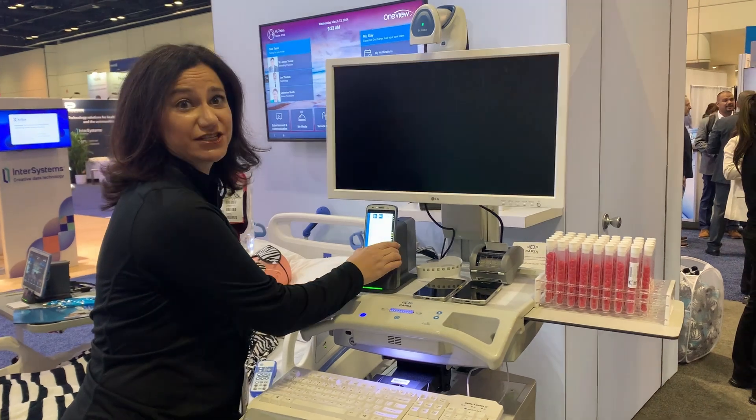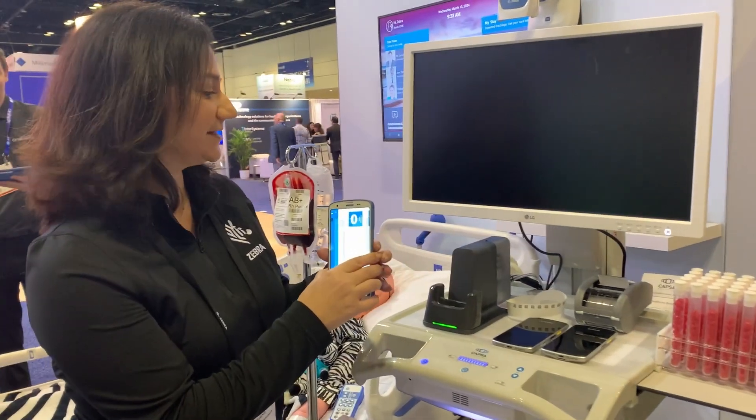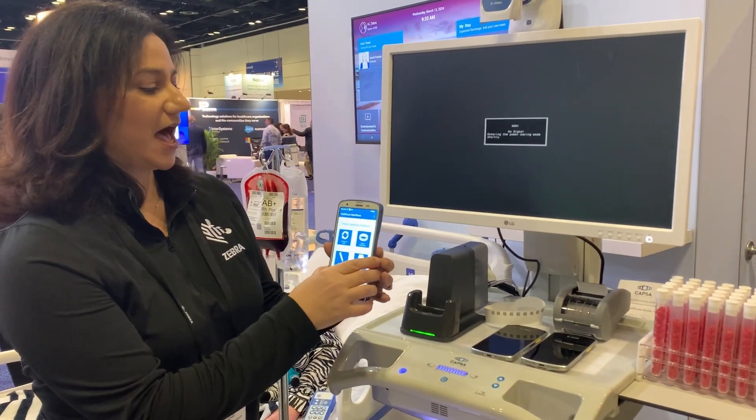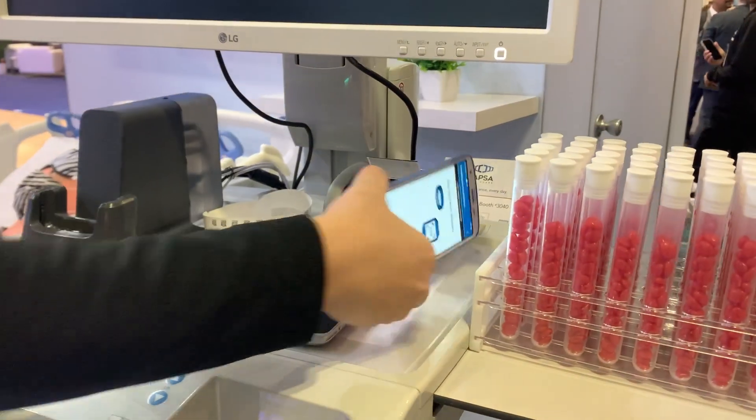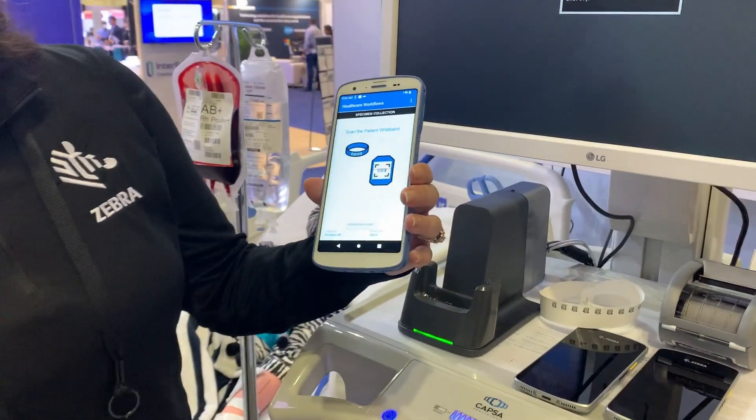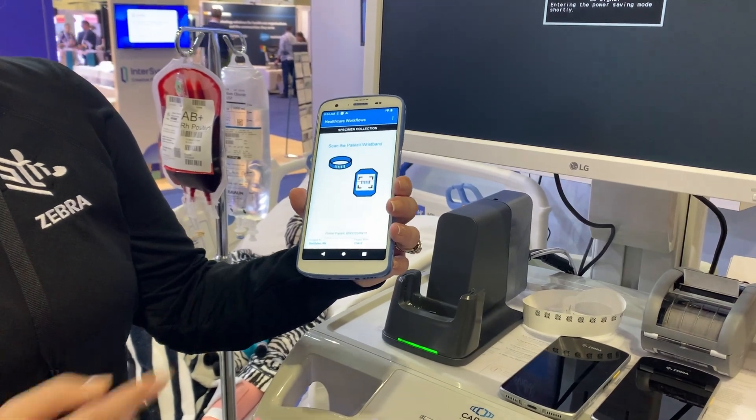This is a new HC50 mobile computer device, and it's coming out of the Workstation Connect. I will show you that we will tap to pair with the CQ610 Plus printer, and it is now paired.